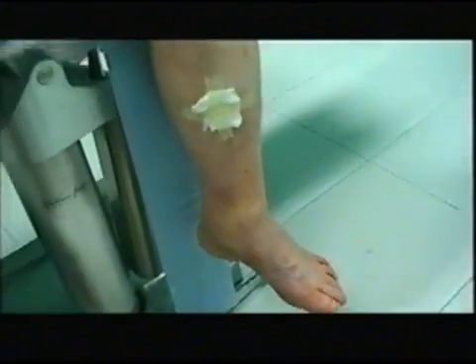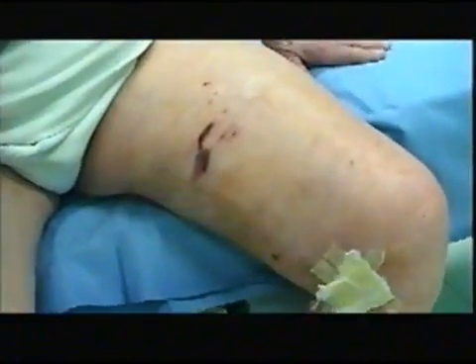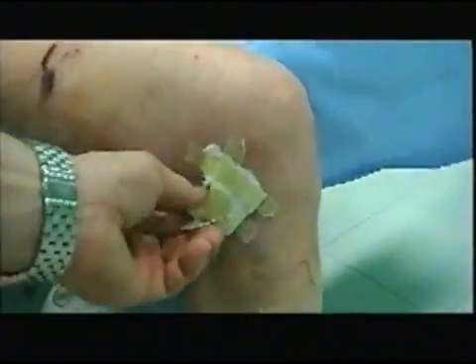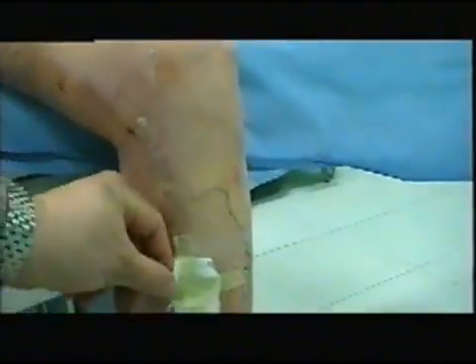A week later, at the control check-up, we observed that the leg skin is well-preserved with no burn damage due to laser heat and no vein disease. At doppler examination, the only ecchymotic appearance is up in the thigh.